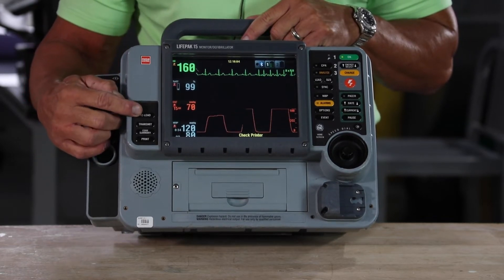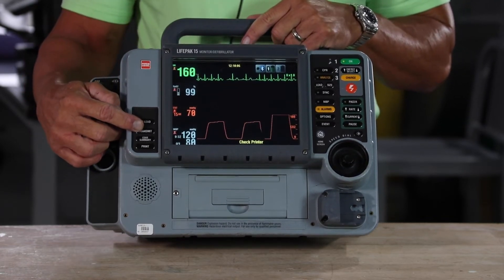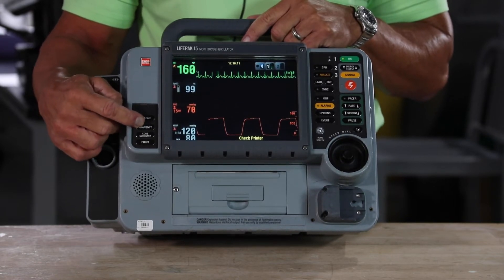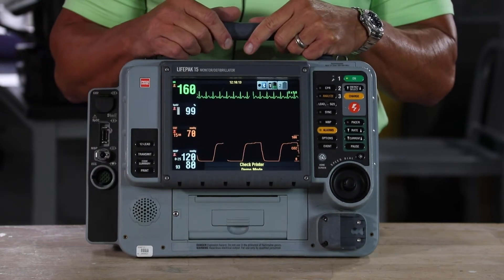Here's your 12-lead button and here's your transmit — whether you want to transmit to your tablet or to the hospital, it's a simple one touch of a button. It's the easiest device on the market to use.